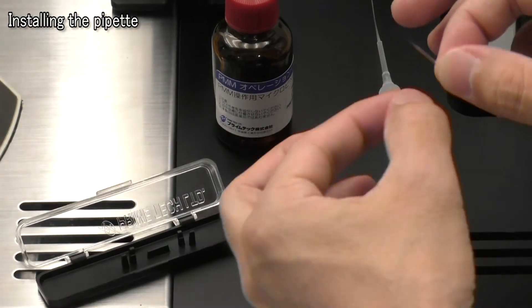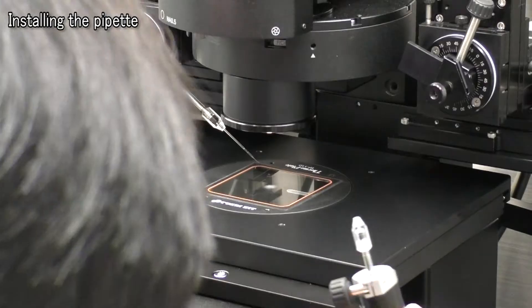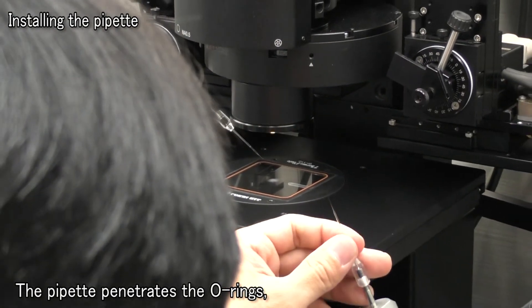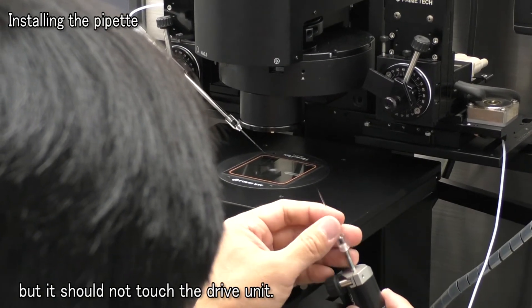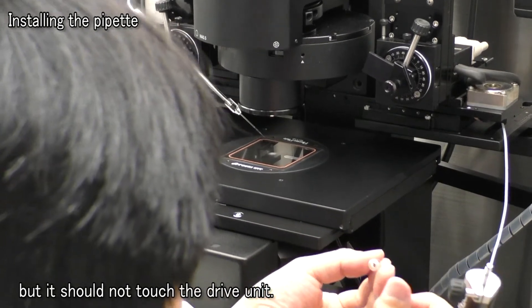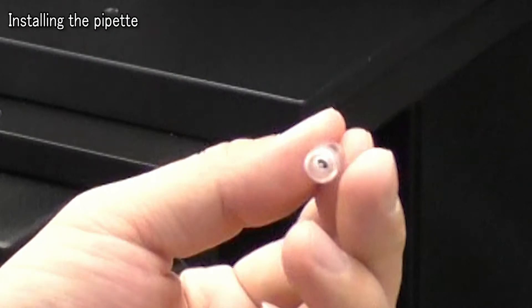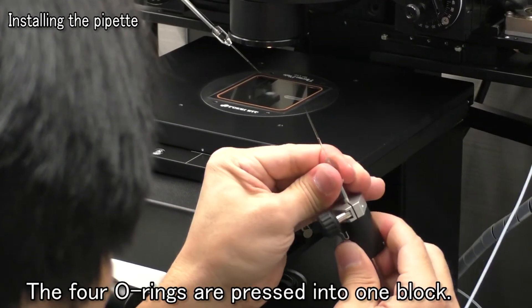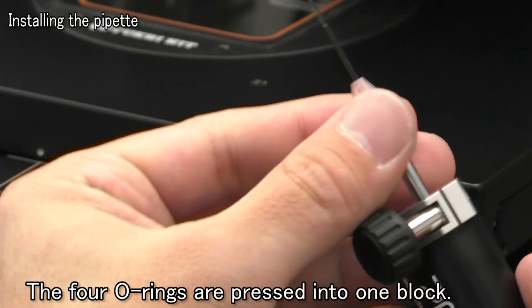Install the pipette in the injection holder. Insert the pipette into the black O-rings until about 5 mm is protruding. The effectiveness of the PMM will decrease if the pipette is not sufficiently protruding or is protruding too much. Strongly tighten the holder grip until the four O-rings are pressed together to look like one solid block. Firm fixing will stabilize the effectiveness of the PMM.